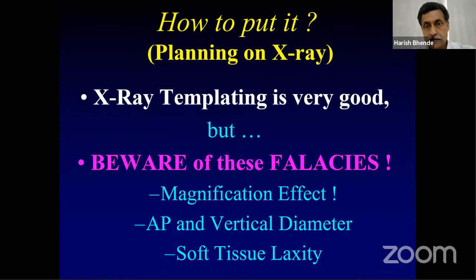Now, we must know exactly what the magnification is. And another thing which people do not realize is that at the bottom, they have given a magnification figure, but that is not actually the magnification of the bone with respect to what you see. It is a magnification or reduction of the digitally recorded image on the X-ray film. So that 100% X-ray doesn't necessarily mean we are getting the same magnification as the actual human bone. There is a simple way of overcoming this magnification effect, especially on a digital X-ray, and we'll come to that.